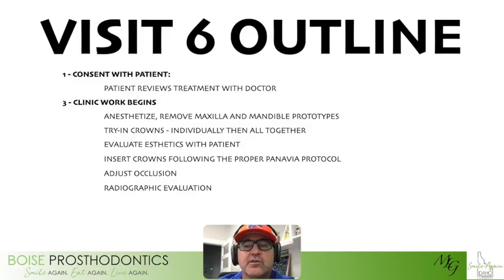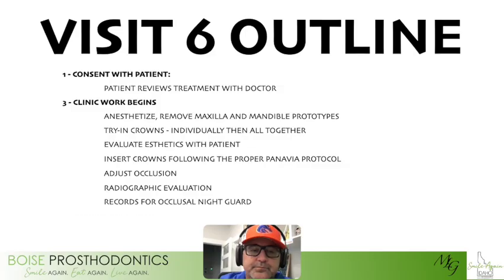And then if they do, then I insert them, usually 2 or 3 at a time to make sure they just fit. Every time you cement some in, there's a little discrepancy in how they fit together. You just have to confirm and adjust the interproximals so that they fit perfectly. It's kind of a tedious process, but it is phenomenal and is absolutely necessary. And so once we're done, the patient goes home.